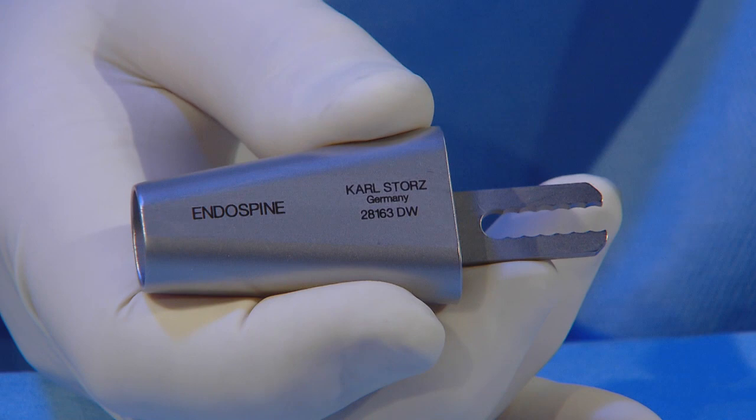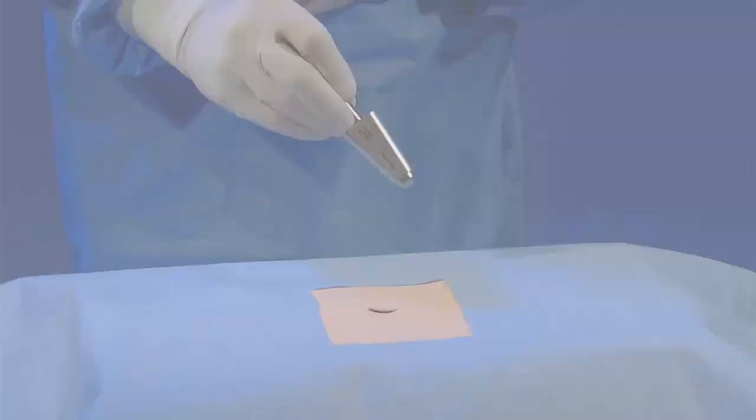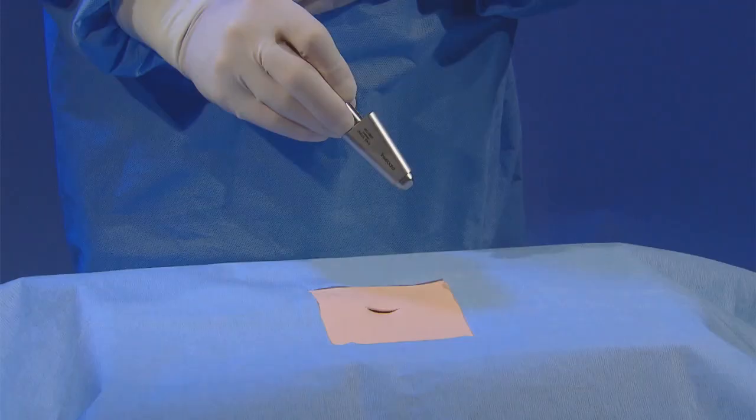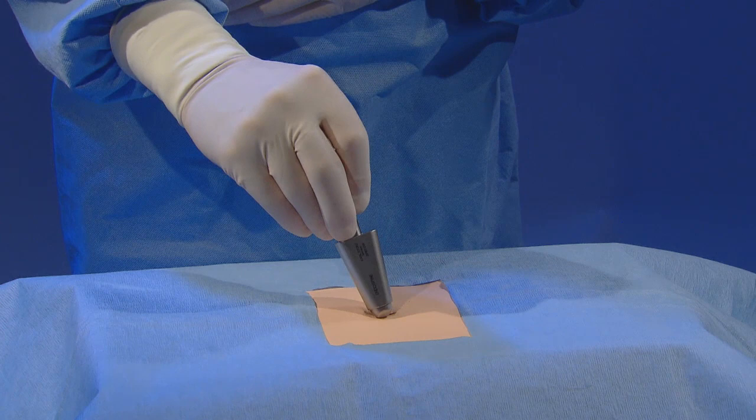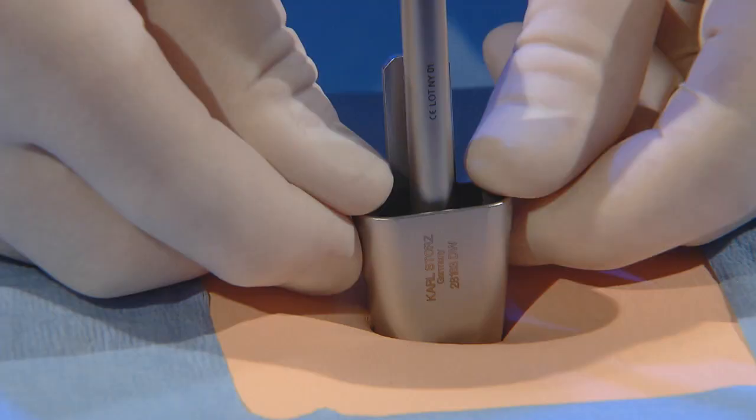The endospine system consists of a speculum equipped with an obturator. The unit is inserted along the spinal processes. Pressing with the thumbs on the edges of the speculum releases the obturator and facilitates its withdrawal.